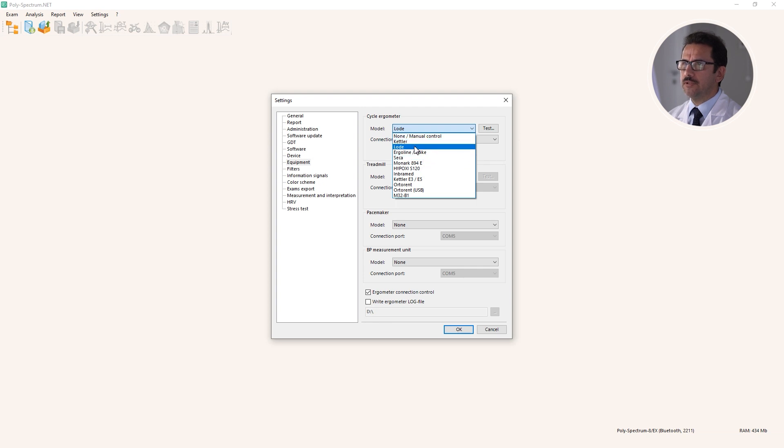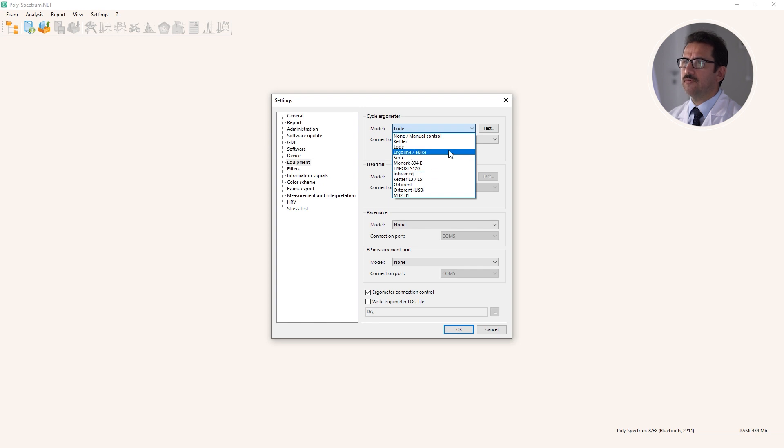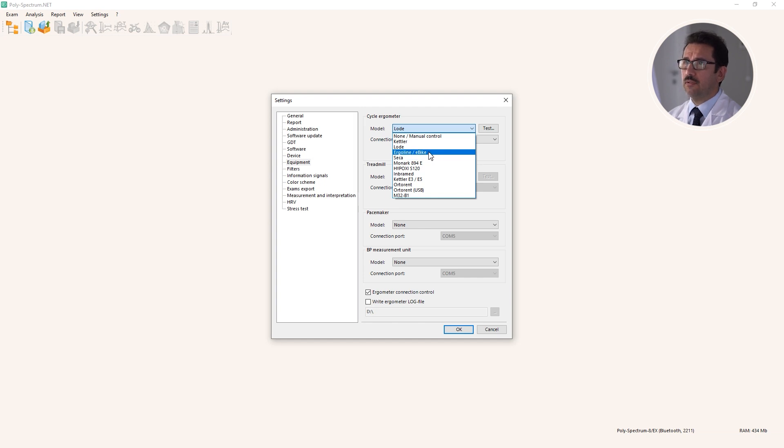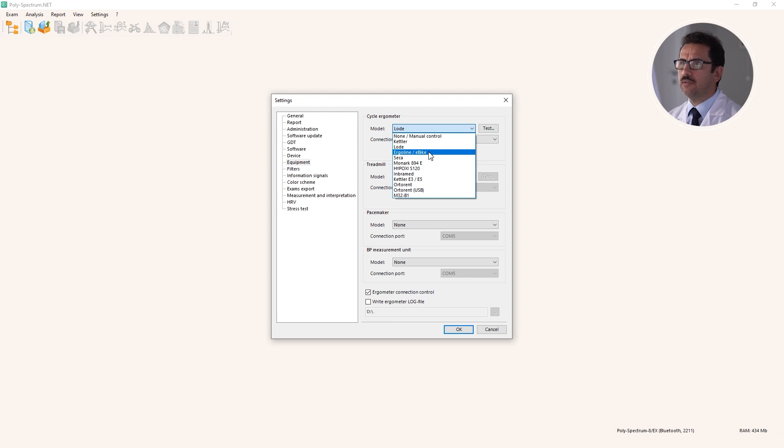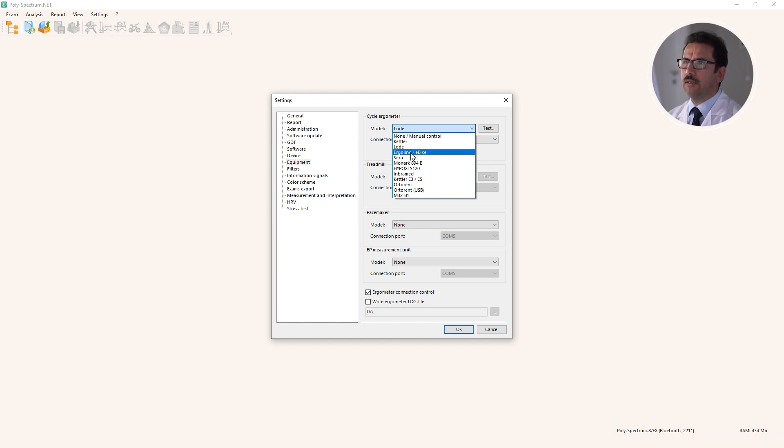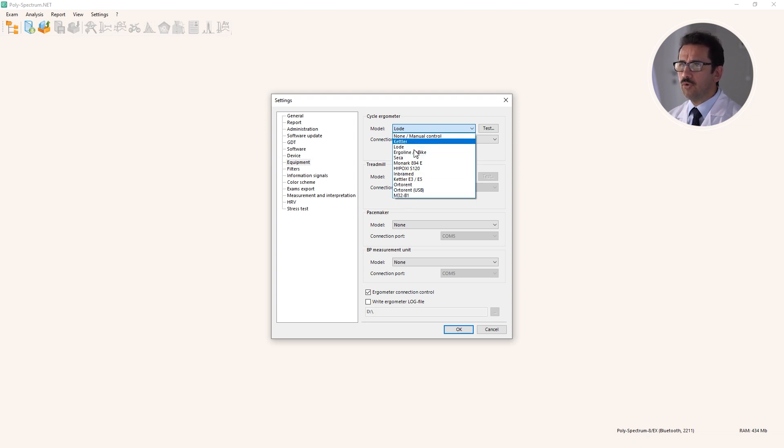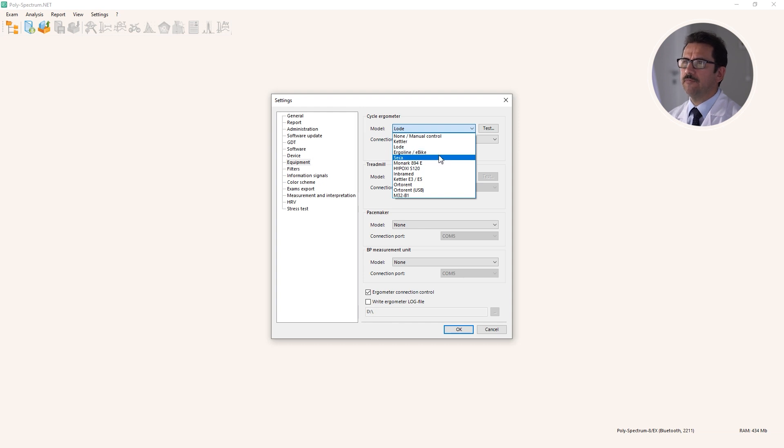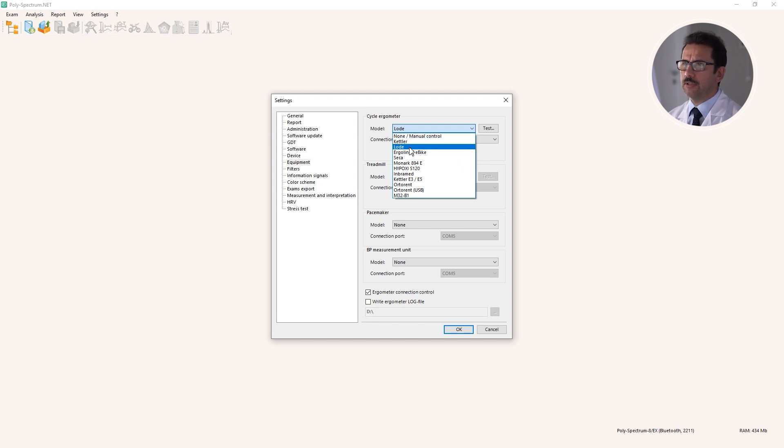This means that you have different options. What's important, for example, we have Ergoline exercise protocol. If you have some different brand name of the bike or bicycle, you can check the user manual, and very often you can find that this bicycle supports Ergoline data exchange protocol. This means you don't need to find your model here in this list - you can set Ergoline data exchange protocol on your device and select Ergoline e-bike from the list, and it will be connected and operated by the Polyspectrum software correctly.